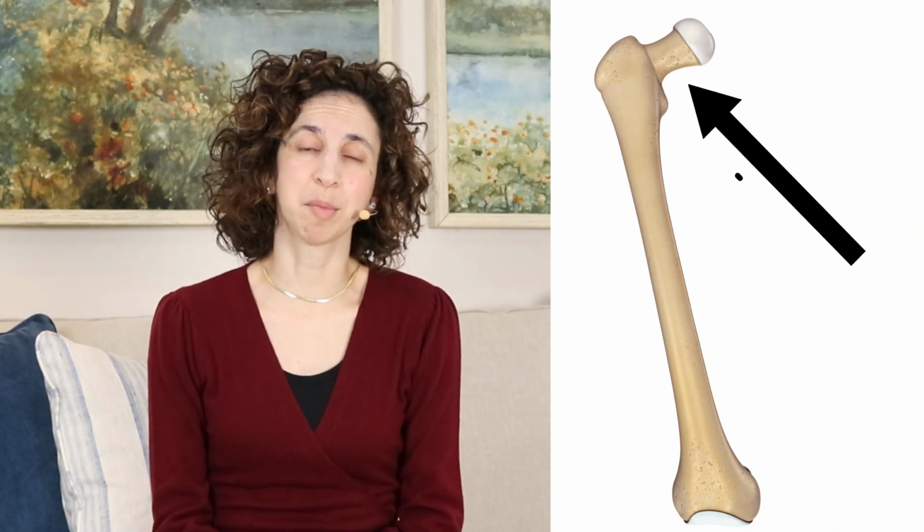A common place of confusion is when someone gets their DEXA back and it says that they have osteoporosis in their femoral neck. This can cause immediate concern over a possible fracture in the neck. But you don't need to worry about your neck in this instance. The femoral neck actually refers to the top of your femur bone, which is the big bone in your thigh where it connects to your hip. This is a common fracture point.